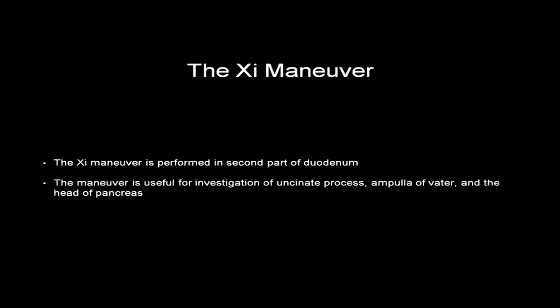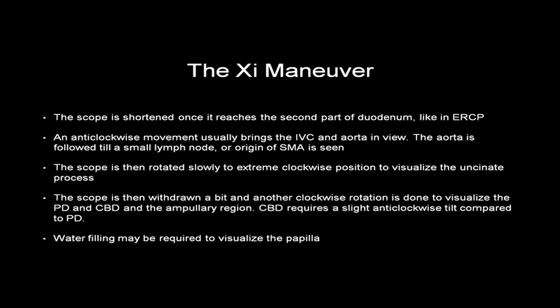The third maneuver, the Z maneuver, is performed in the second part of the duodenum. This maneuver is useful for investigation of the uncinate process, the ampulla of Vater, and the head of the pancreas. To perform the Z maneuver, the scope is introduced into the second part of the duodenum and then shortened, as in ERCP.